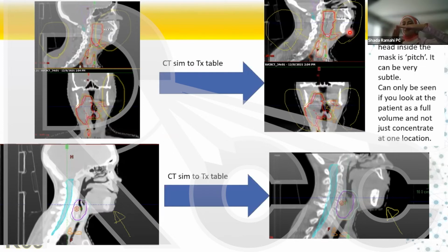So if the entire patient has a pitch, يعني كيف? If you look at me, the entire patient is this or this, then the couch can account for that. But if my upper neck is fine and just the chin is like that, this cannot be corrected, right? Because this means that part of the couch has to go up and the rest should stay, and you cannot do that. The couch is not deformable. So what you end up doing, you end up compromising. Yani, wasat is not good enough when you're doing stereotactic.